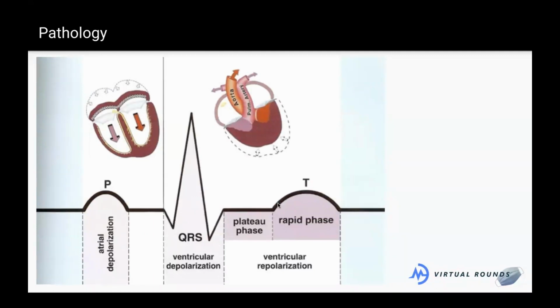And then because it sent a signal, it kind of has to reset. So this is the ventricle trying to reset so it's able to contract again. And remember, as this squeezes, we're sending blood simultaneously out into either lung and out into the body. So this is basically how an EKG works.